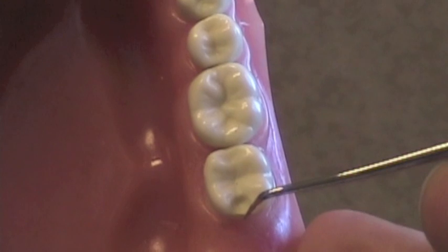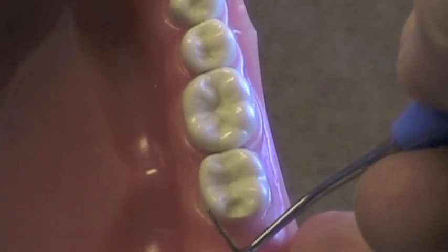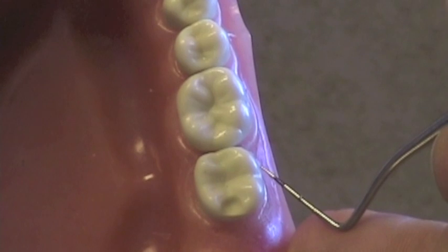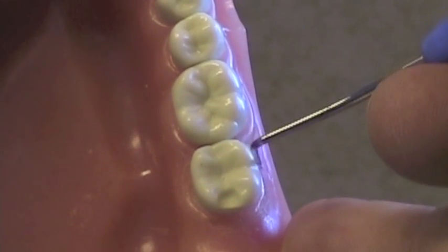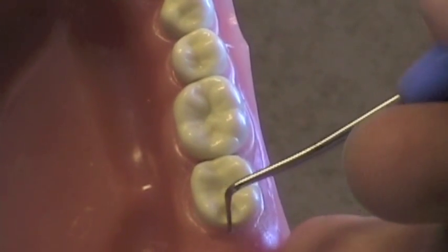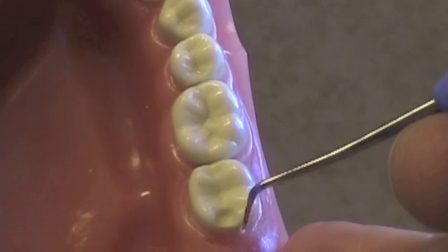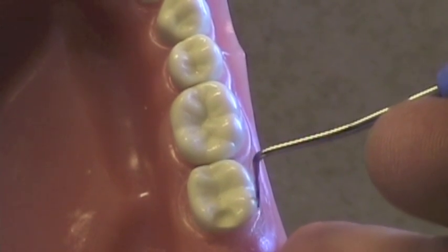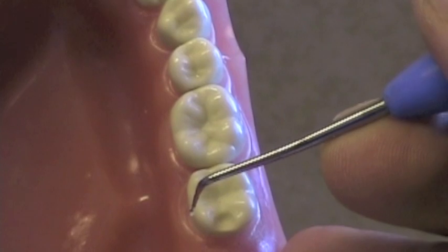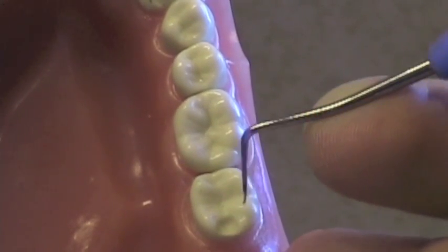Here's a case where I have a tooth that's going to have a distal rest, a mesial buccal retentive arm, and also a lingual bracing arm. The bracing arm is rigid. Remember, the only flexible part of a removable partial denture is the terminal third of the retentive arm on the mesial buccal aspect. All other surfaces — buccal, distal, and lingual — are rigid and need guiding planes. So I'm preparing the guide plane from the lingual, around the distal, to about mid-buccal, rounding the corners at the distal lingual and distal buccal, keeping the tooth's round shape without removing cusp structure.